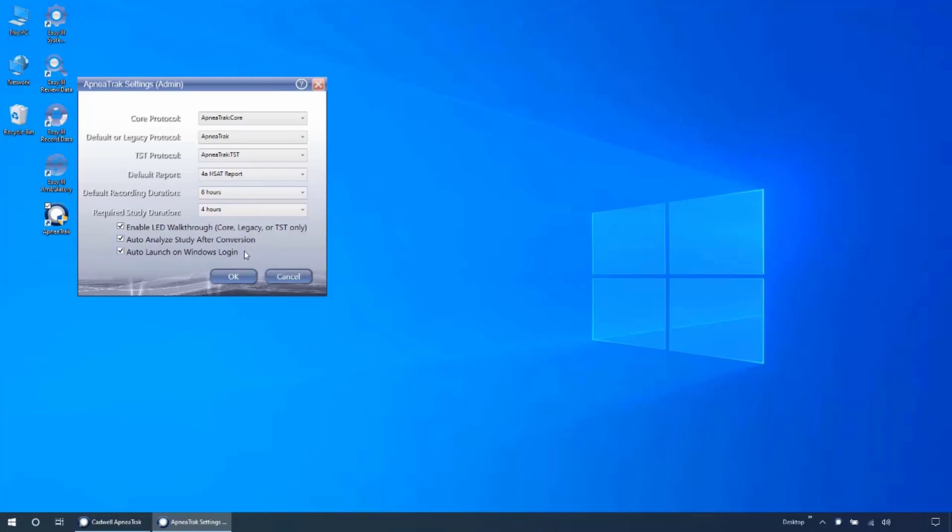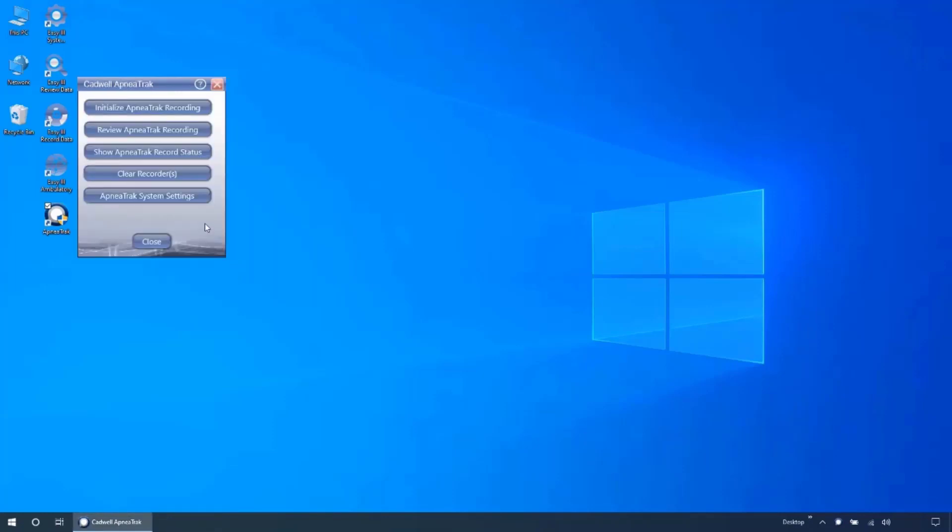Auto-launch on Windows login will determine if ApneaTrak will start with your computer. Disabling this will mean after each reboot, the computer will not be able to automatically detect an ApneaTrak device until the ApneaTrak application has been launched.